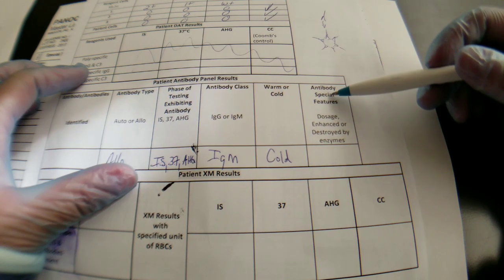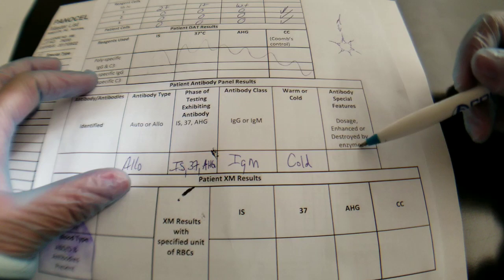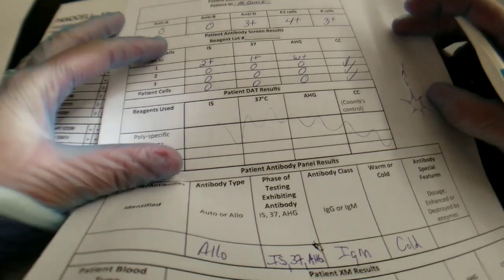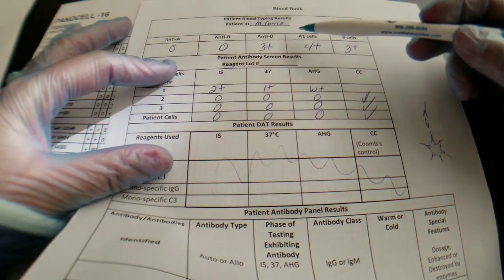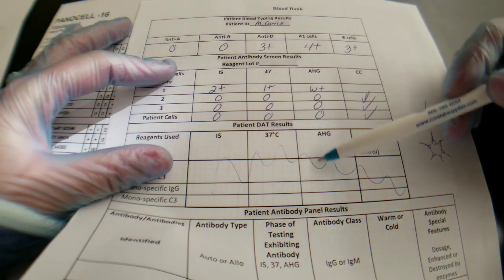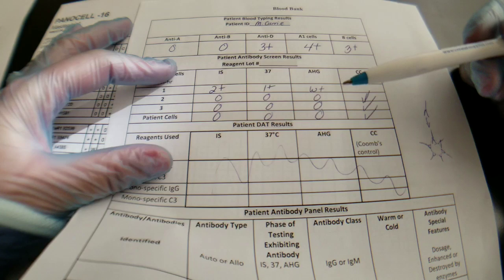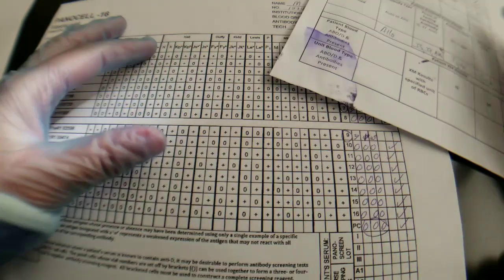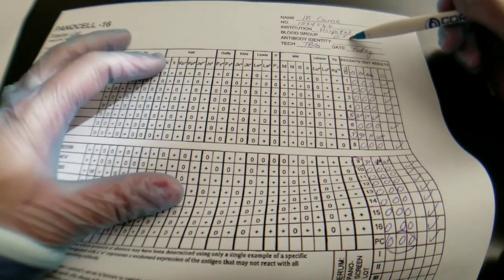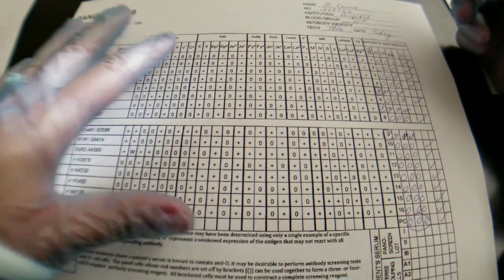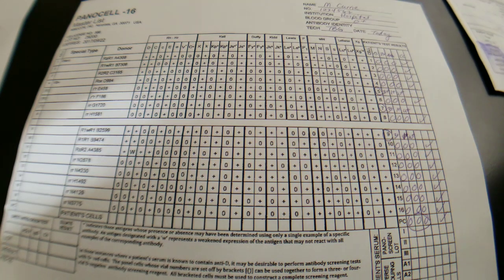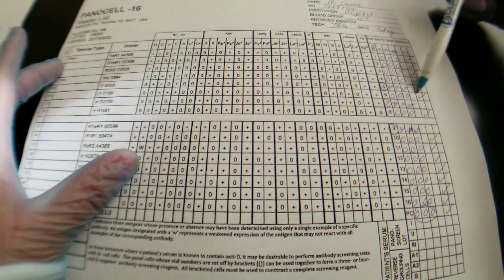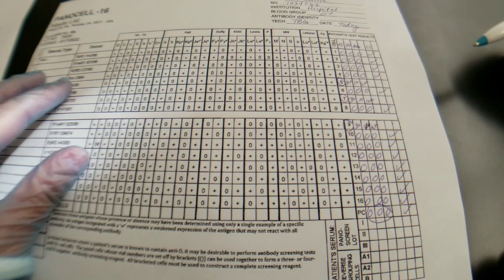So when we identify the antibody, we're going to be able to answer this block here. For those of you that don't know, this is a printout of our LIS that I made for our program and it is showing you all the results that we have done so far of this patient, which you have seen in other videos as well. This patient is an O positive patient, and that's already recorded on the identification panel. So what I'm going to do to start out is I'm going to highlight the lines of the donor cells that the patient was positive in.